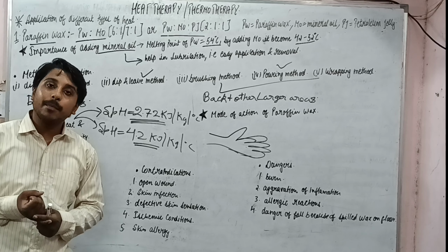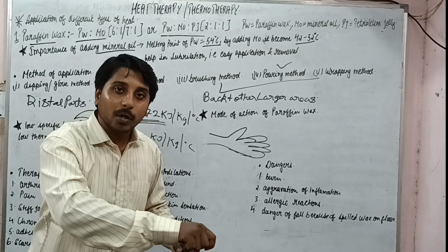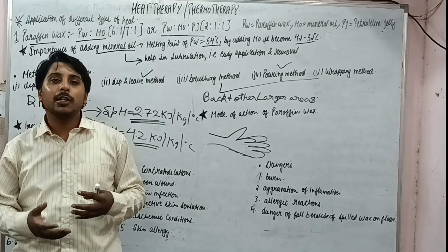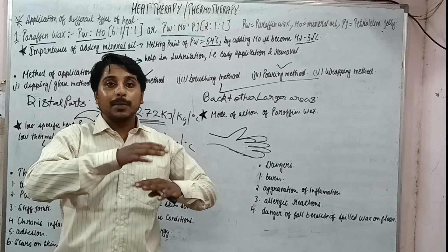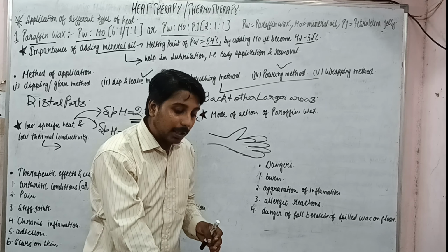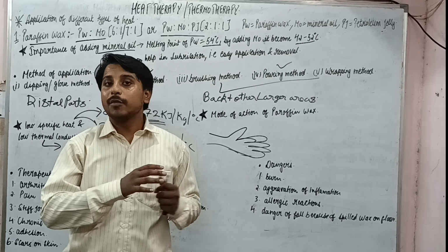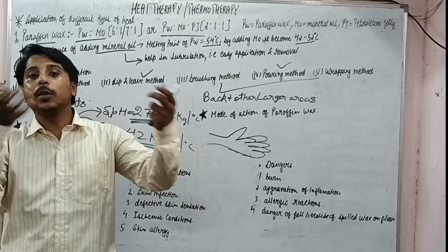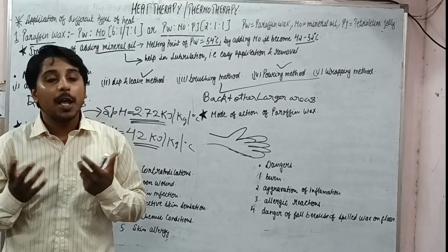collected. Okay, so how can you purify the wax? Put your wax into a container, mix some water in it and stir it. Then we will heat it until it melts, not up to boiling, until it is properly melted so that it becomes a liquid. After some time you will see that the dirt will settle down in the container which has water below, and at the upper part there will be only wax. You can carefully remove the wax from the upper part as it solidifies and your wax will be purified.